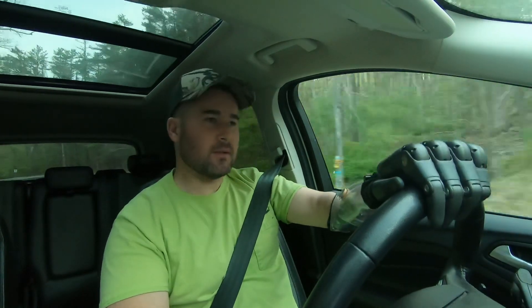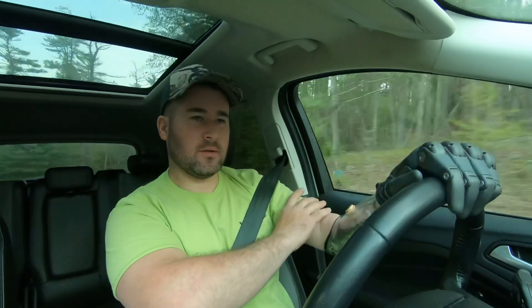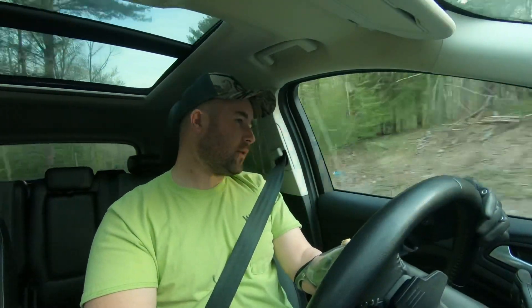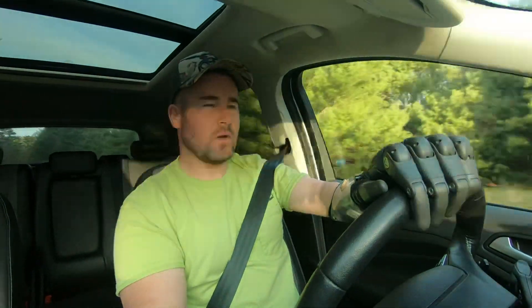Good Wednesday morning everybody. Today I wanted to talk to you about the different sockets in the arms. A socket is where your arm actually goes into the prosthetic arm — the outer socket. There are two different types of sockets that I use and I'm having some issues with them. One design is affecting the other design — if that makes any sense. So that's what we're going to talk about.